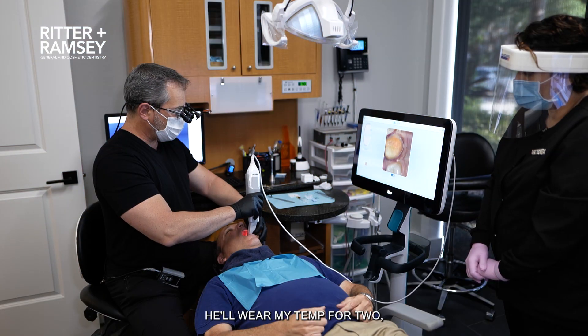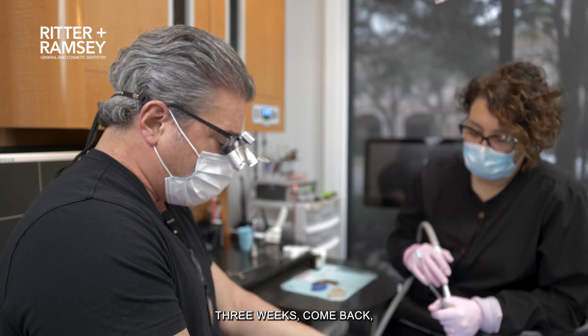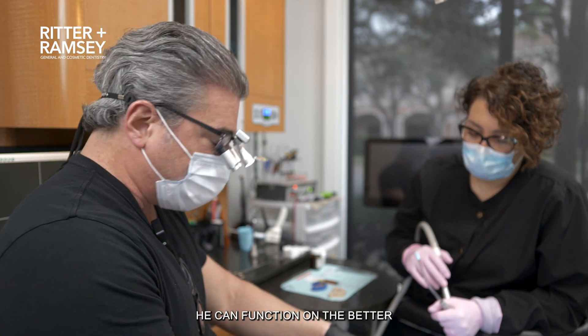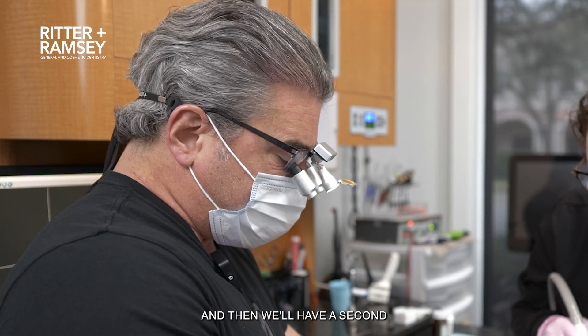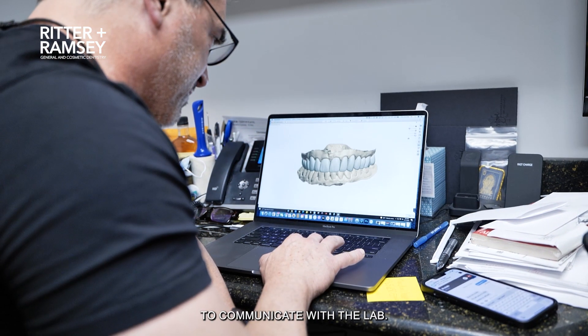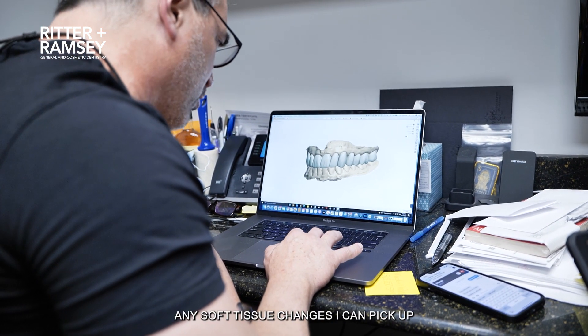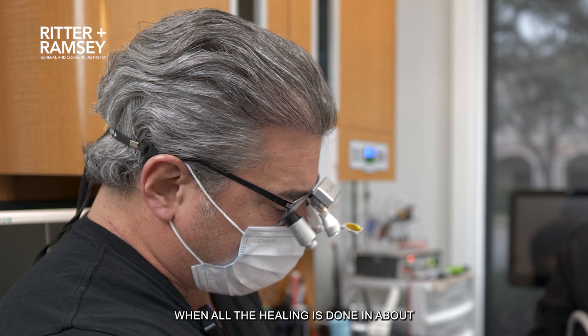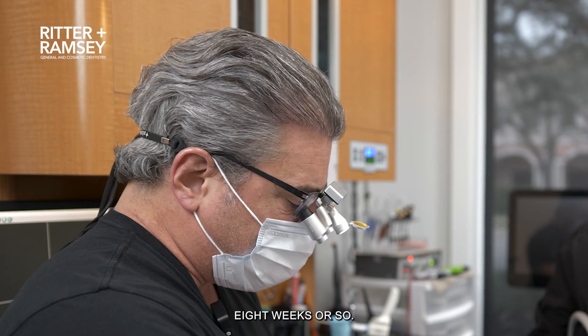So we'll scan all this. He'll wear my temp for two, three weeks, come back, get a PMMA — cement that thing, it will be rock solid. He can function on it better, it's stronger. And then we'll have a second PMMA made as an ability to communicate with the lab. They'll come back, any soft tissue changes I can pick up, and we can move right to the final when all the healing is done in about eight weeks or so.